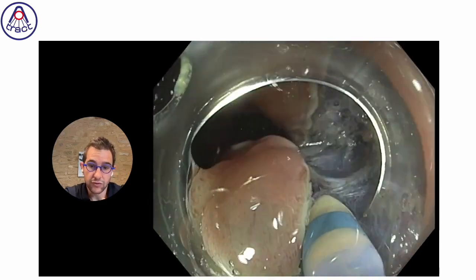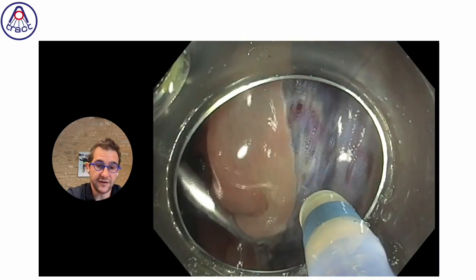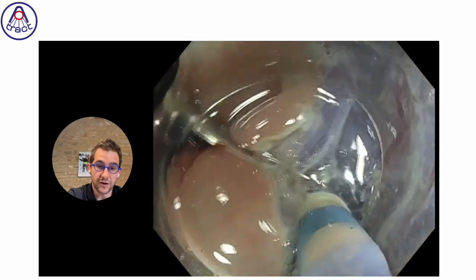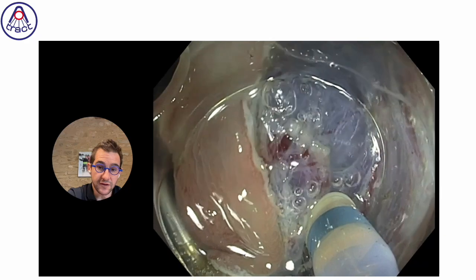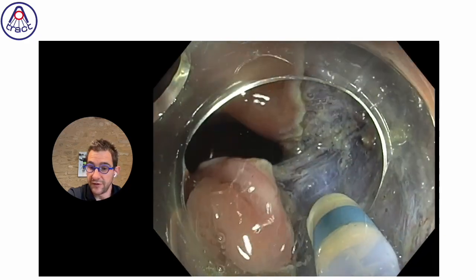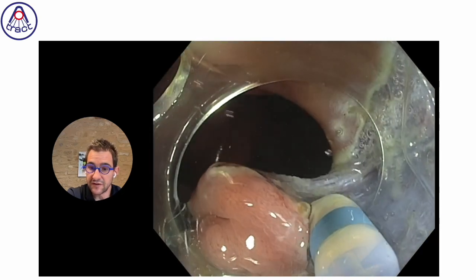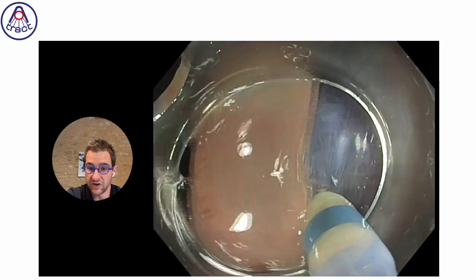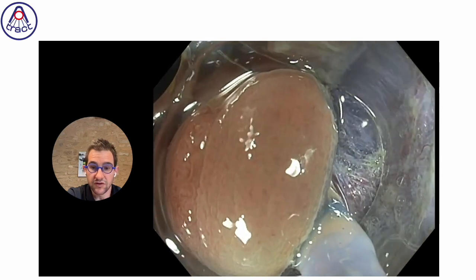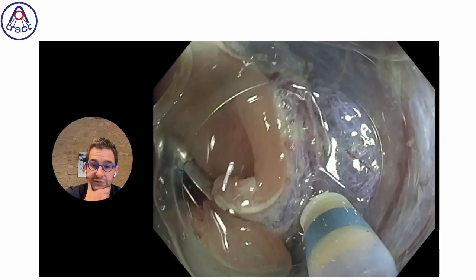It is important to talk about speed in this case because it's a granular LST, which is not malignant, with a very low risk of T1 cancer under 1%. And in this case, there is a debate with piecemeal EMR. En-bloc EMR for this lesion, which in fact is 4.5 centimeters, is not easy to achieve. Possible sometimes, but not easy, and absolutely not easy to predict. So here, the debate depends on the speed of your resection.